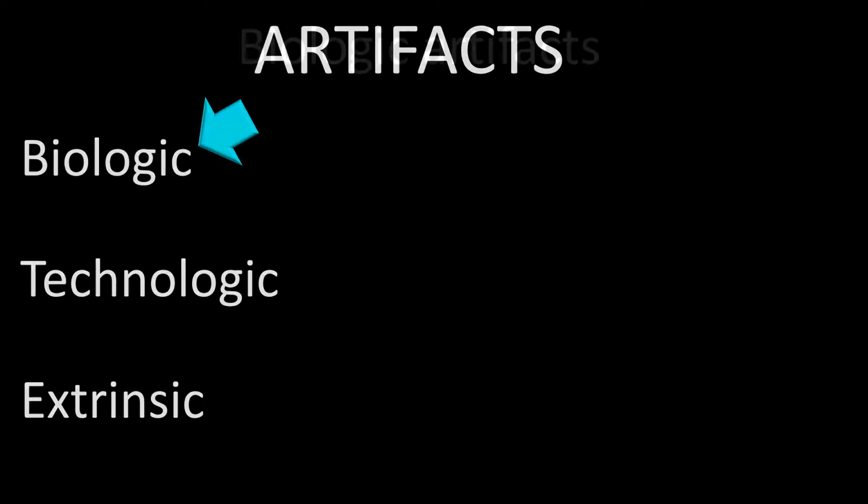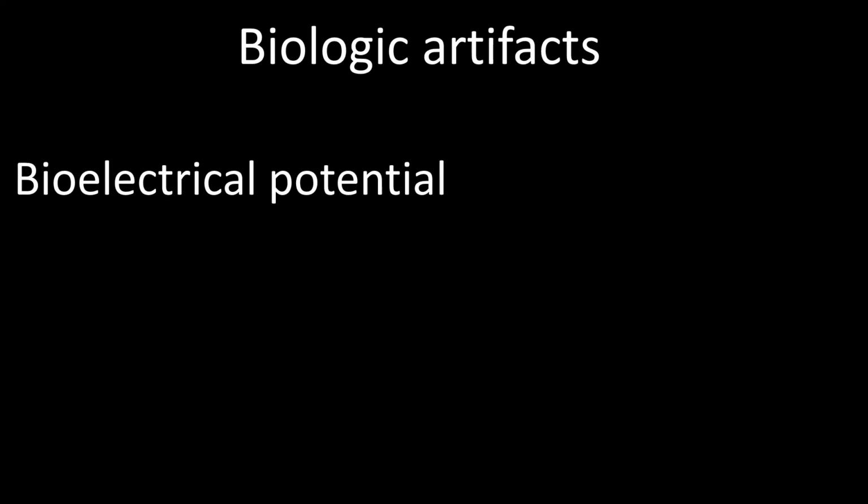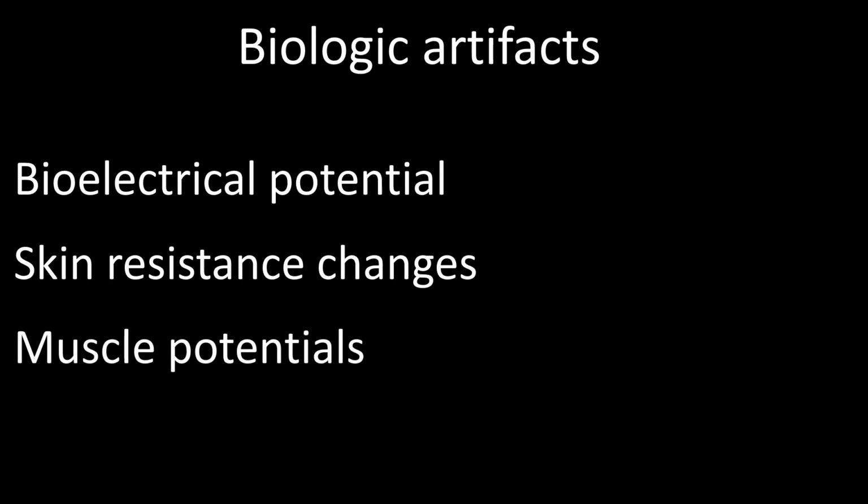Biologic artifacts can be classified as bioelectrical, which are by far the most common of the biologic artifacts, skin-resistant artifacts, muscle potentials, and movement artifacts.